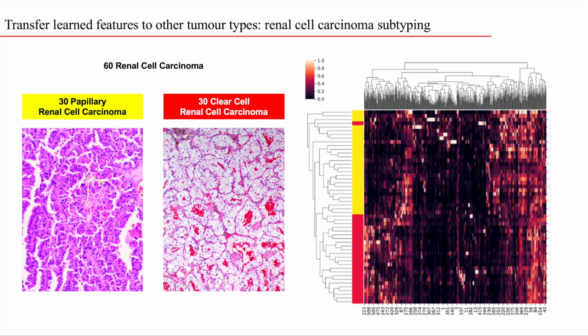Was it that this is in fact the papillary clear cell variant, a variant that could have gone both morphologically, or is this in fact an error? But overall, you can see that it's able to subtype these different types of tumors with really no knowledge of being trained in GU pathology. So we thought that was quite an impressive feat.